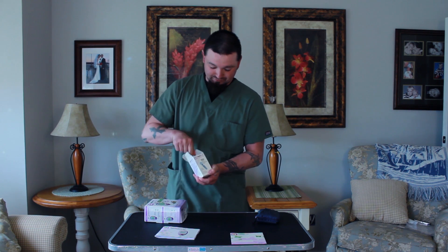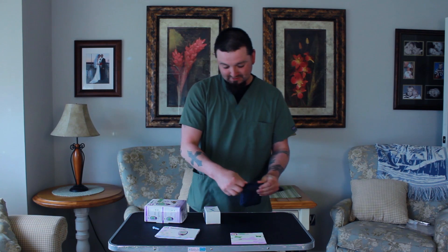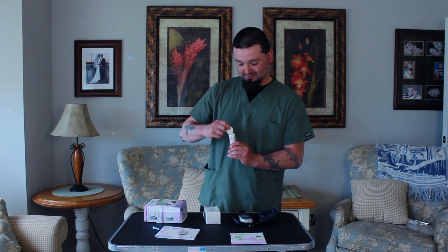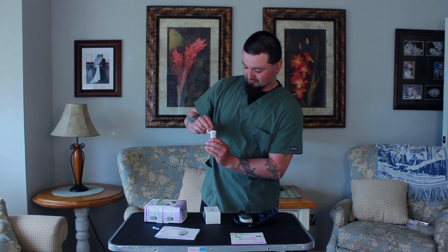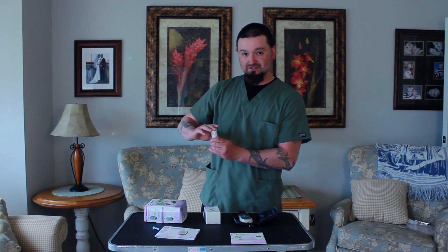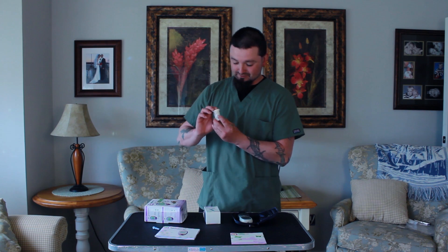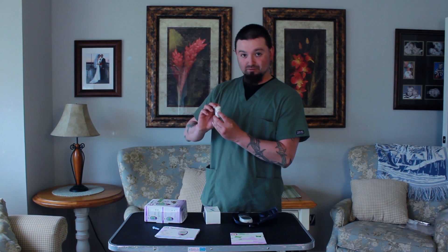You also have sterile lancets. This is what we're going to use to actually slightly poke our pet at home to get our sample. Inside your kit there are strips that we use to test — about 50 inside each container. Each container is a little different; there are numbers on here specific towards dog or cat.